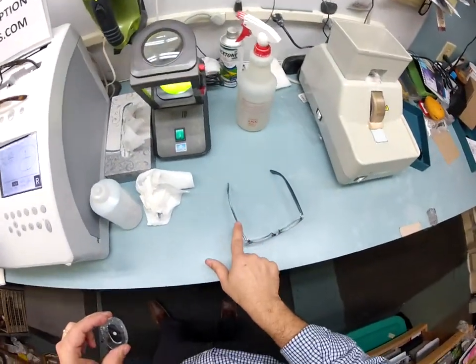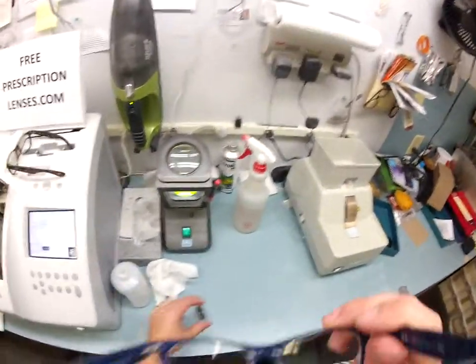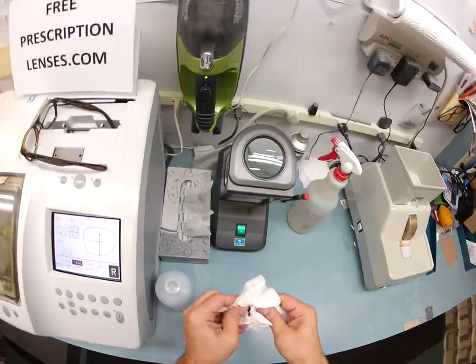So, of course what I was going to demonstrate: when I take mine off, I have one ear that's higher than the other. So when I put my finger down, you see a little bit of a wobble in my glasses. But they sit level on me. Alright, hang on, let me get this adjusted. There we go. Okay, again, I'm going to dry your lens off so it's not slippery.